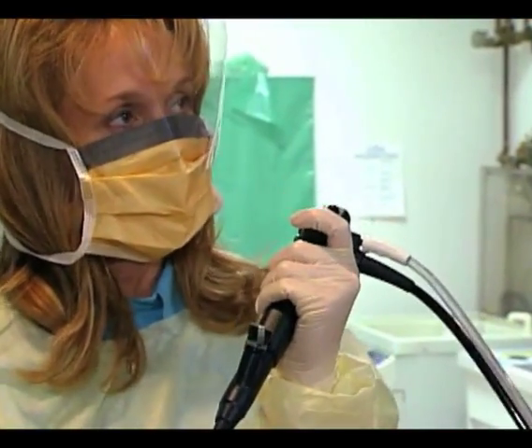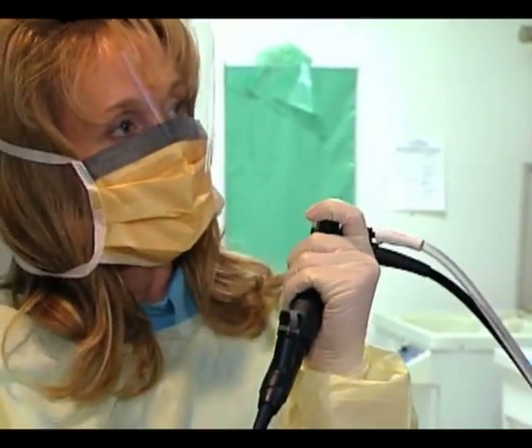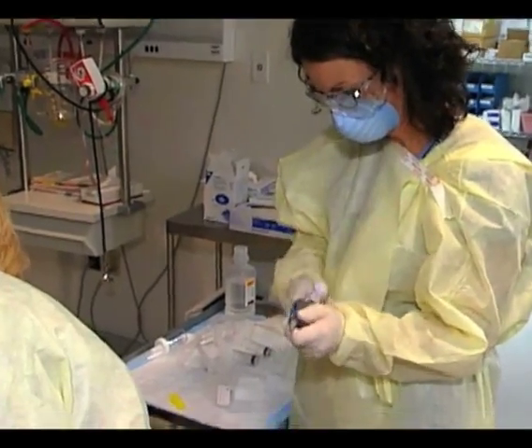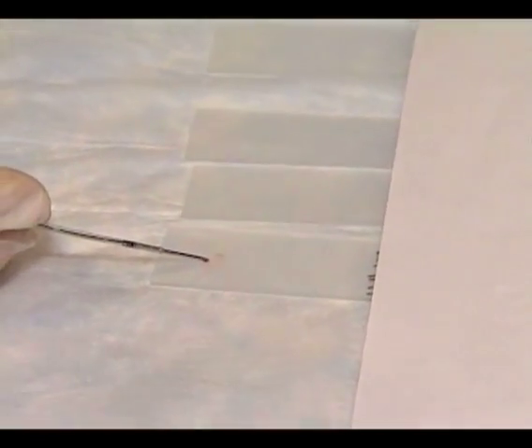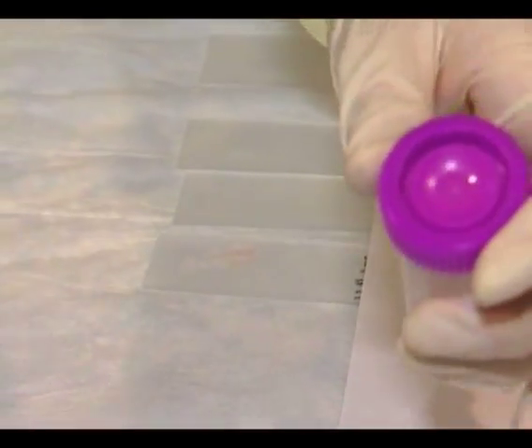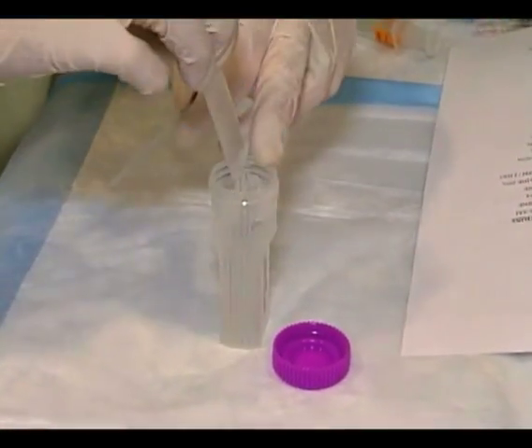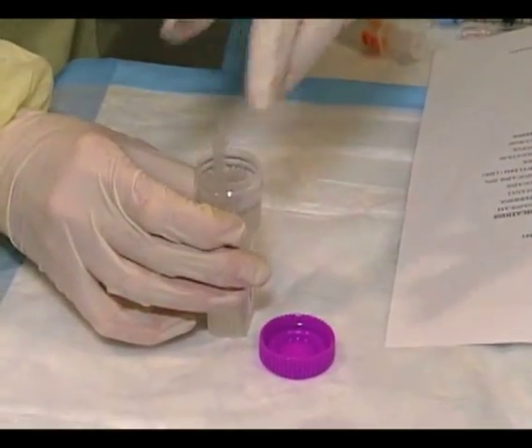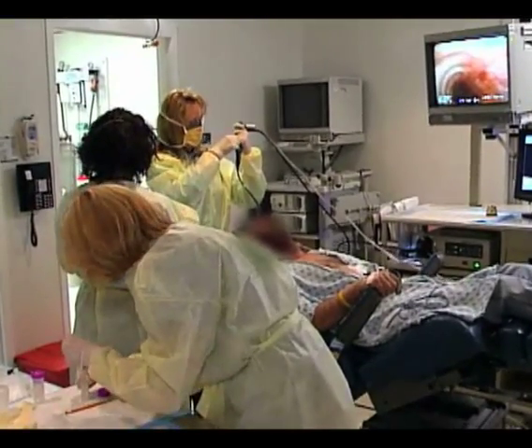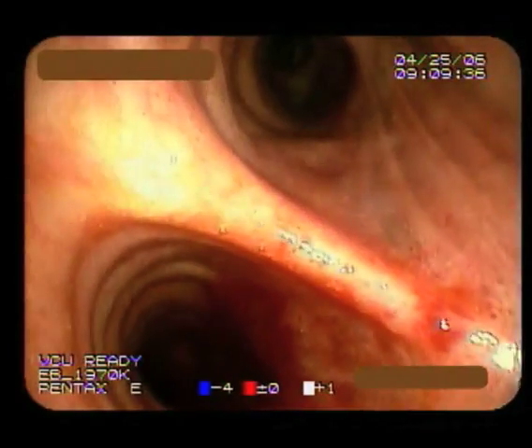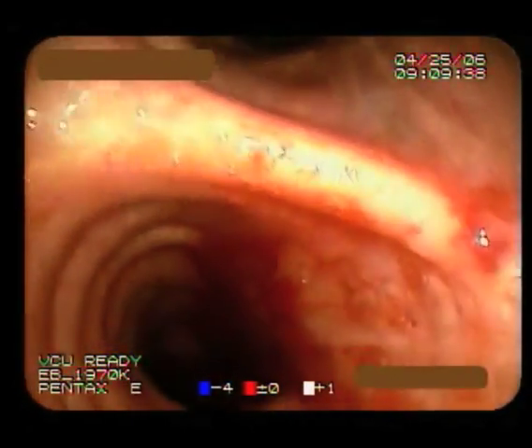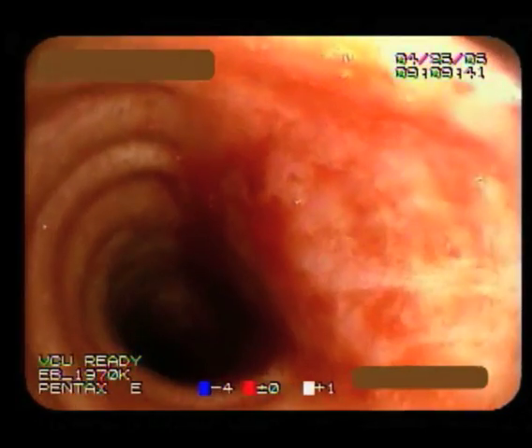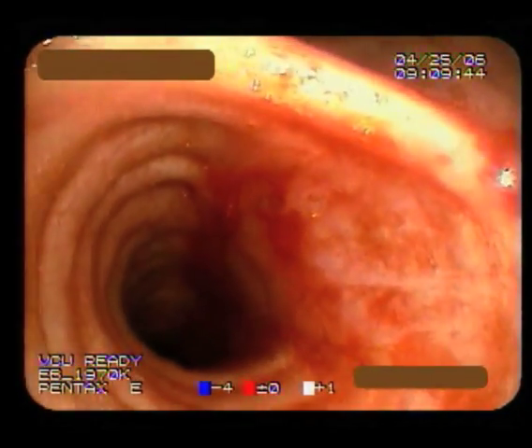I'm going to pull it through for specimen collection in one straight pull, so as not to damage the needle or the scope. I generally like to take five to six passes to achieve the specimen. We'll attempt four other sample sites, all in the same vicinity looking for the subcarinal target. I like to approach different angles, but the key is getting between the inner cartilaginous rings, not paralleled down the respiratory mucosa, but going perpendicular into the lesion to get ample tissue.